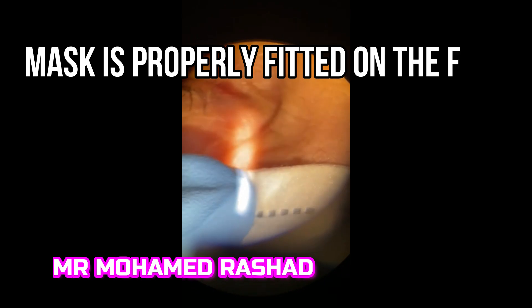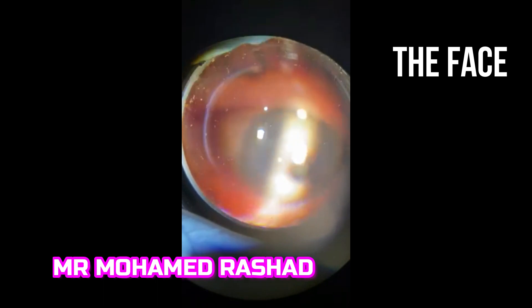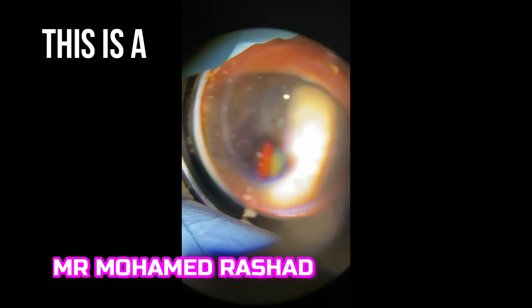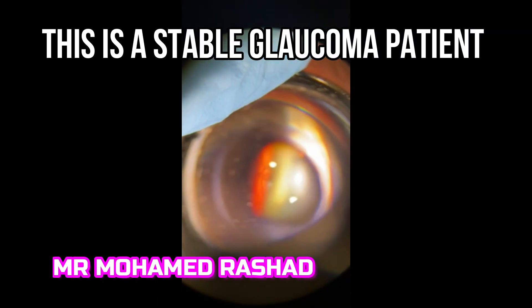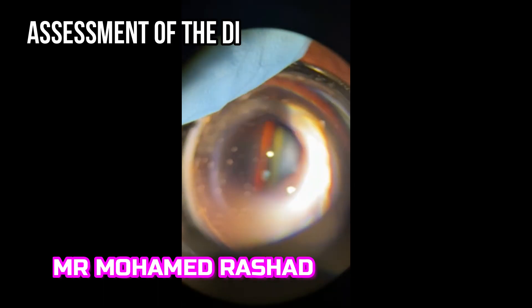I'm helping the patient to properly fit the mask and there is no gap between the mask and the face. Now you can examine the fundus clearly without any fogging.